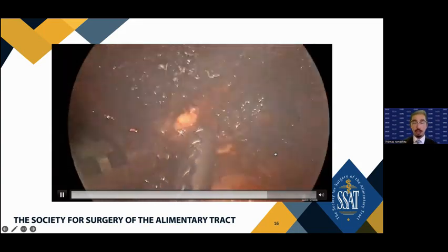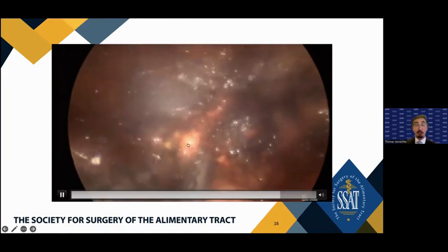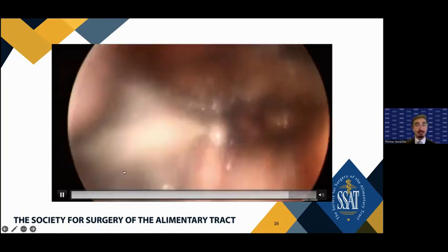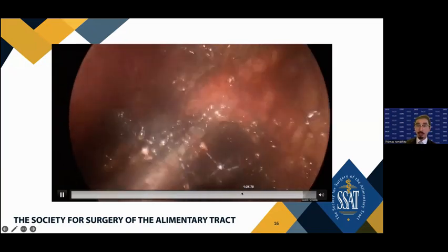Some people do it with the ligature. I prefer the harmonic because I think it bleeds less, but a stapler is also appropriate, which is why the 12 port is the only port that I'm not giving up on from a size perspective, because in case of an emergency, you have access for a stapler. So here's the full removal of the wedge of the adrenal gland.